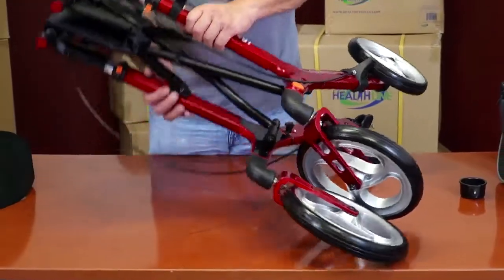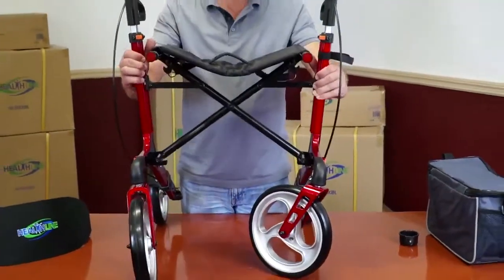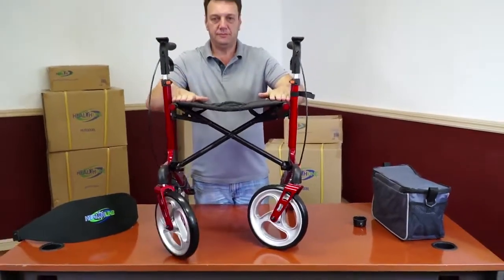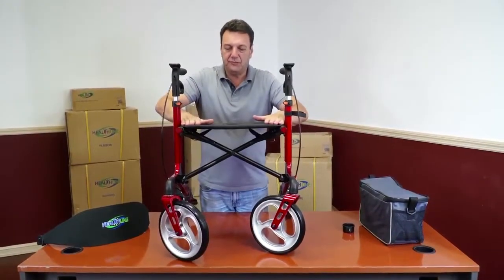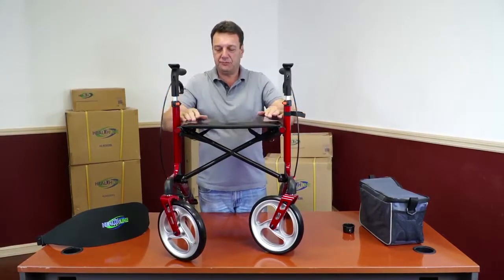Finishing the main assembly. Once all the wheels are in place, set the rollator upright and spread the sides apart as seen on the video. Firmly press onto both ends of the seat simultaneously until you hear the frame snap into proper position.